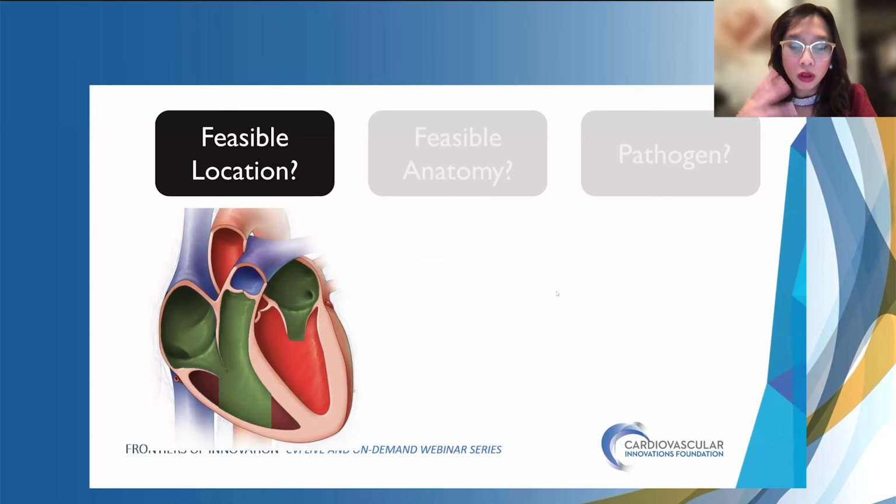So I think using all views, but subvalvular, I love the transgastric and the deep gastric views to really visualize the subvalvular apparatus and to ensure that you don't get any complications in terms of torn cords or the papillary muscle, any interaction of the catheters with the subvalvular apparatus as you do the AngioVac.